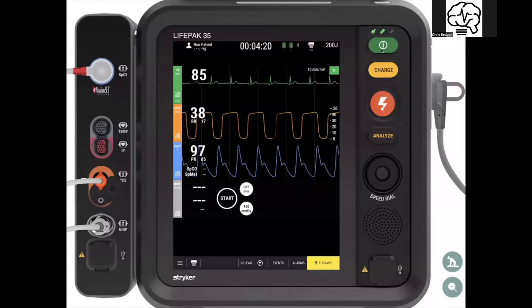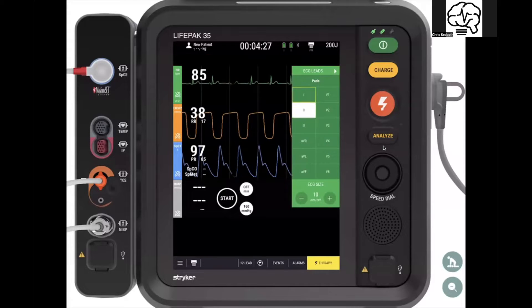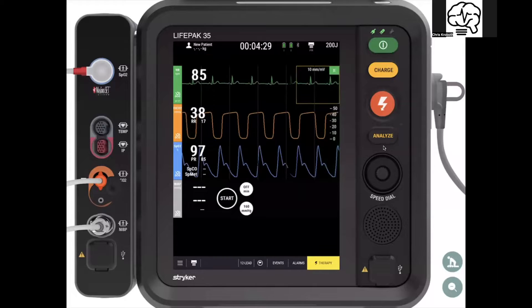To the right, you see a lot of the traditional buttons — the power, charge, shock, analyze — and it still has the dial. You can still cycle through with the dial just like you would with the 15 or the 12 in the past.